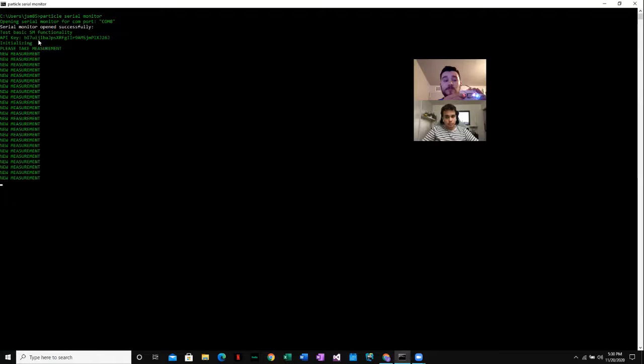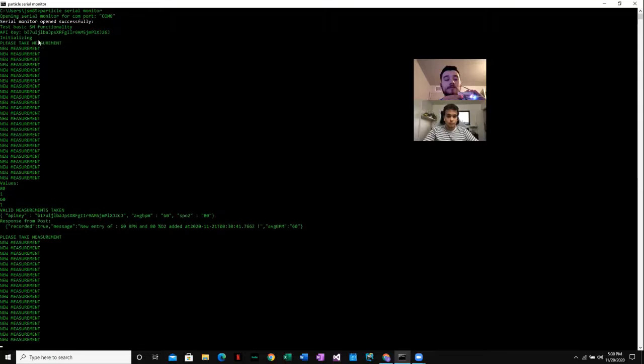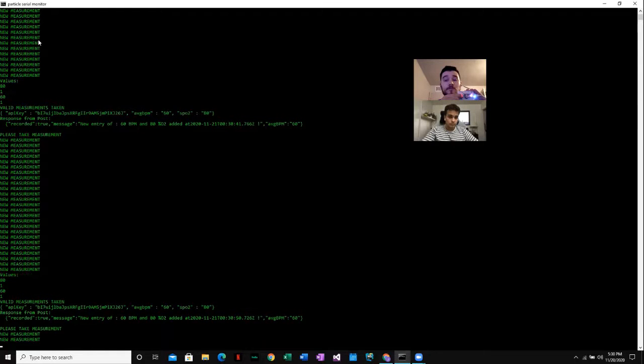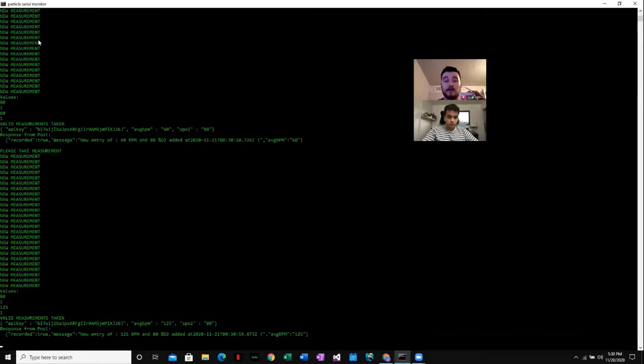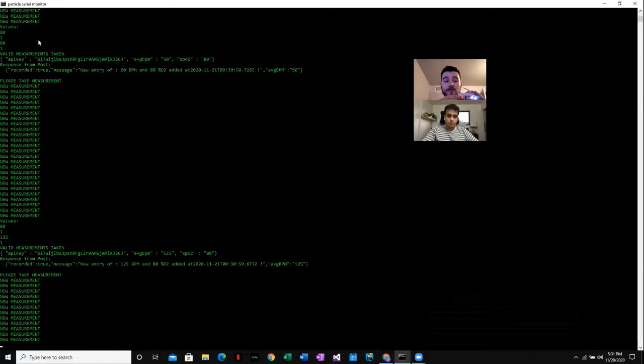And then we see new measurements go through, and we did get a valid reading, and that did get posted. I'm going to go ahead and add a couple more measurements here, just so that we see what the actual display looks like. And you'll see that once the Particle does finish taking a measurement, it will go back to yellow and then start blinking blue after that time frequency has been reached. I'll go ahead and do one more here.